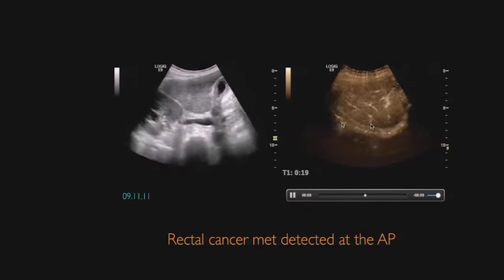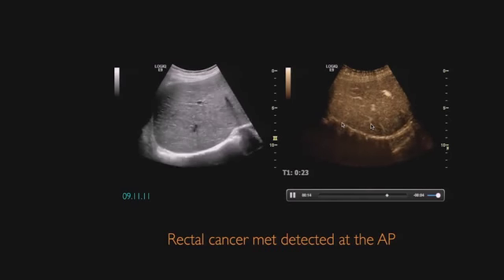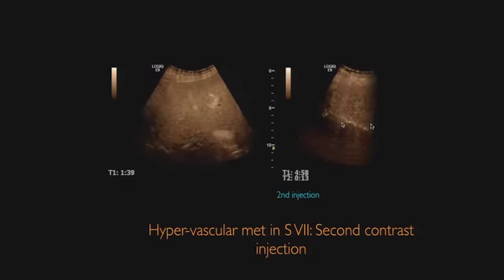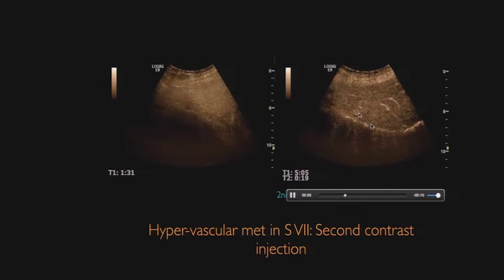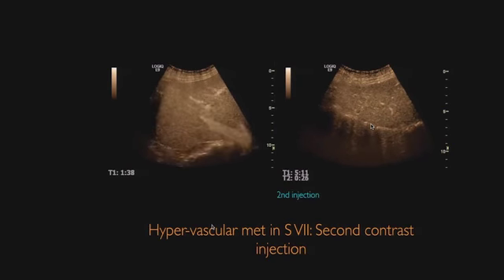And then, of course, we can say, okay, do we really believe in that? Let's do it again. Okay, so now you see the washed out lesion quite nicely. And then we give a second injection in order to see, is it really hyper-enhanced during the arterial phase? Here it is. You can see the supplying artery. This is the tiny artery supplying this tumor. So this is something that you can see for, let's say, 3-4 seconds. But this is maybe an advantage to characterize a tumor. That is what we can do.